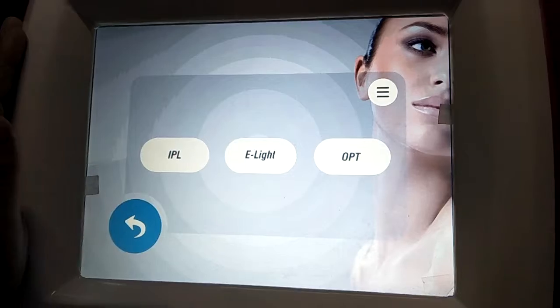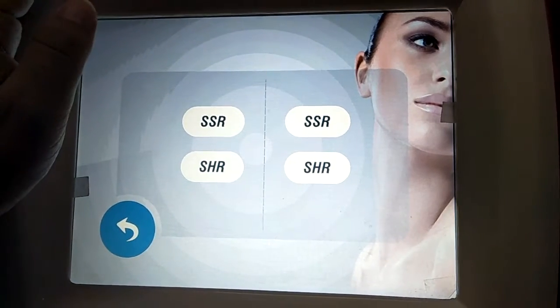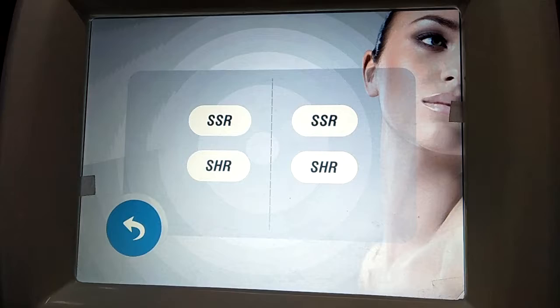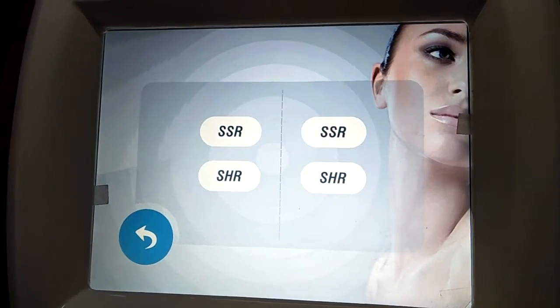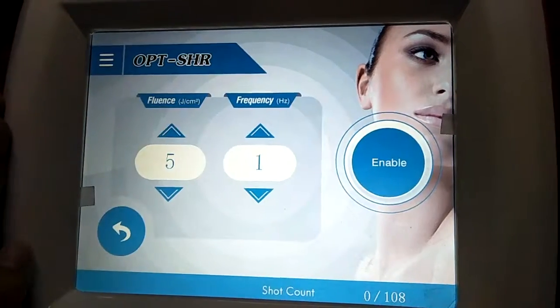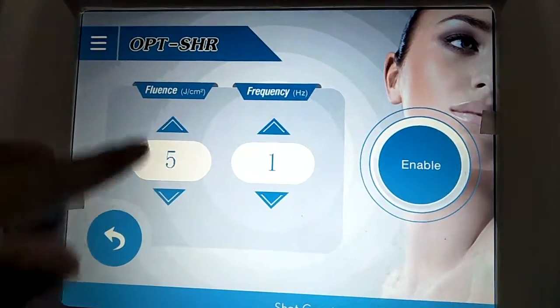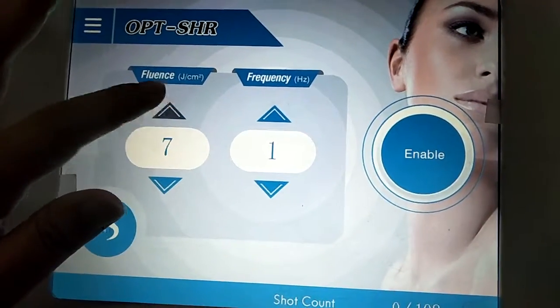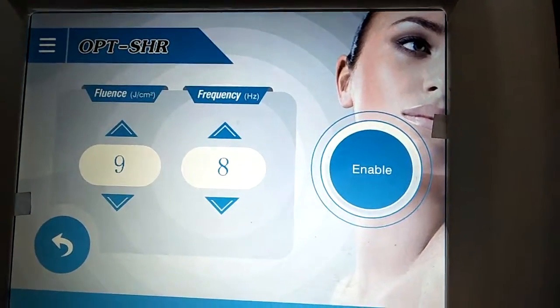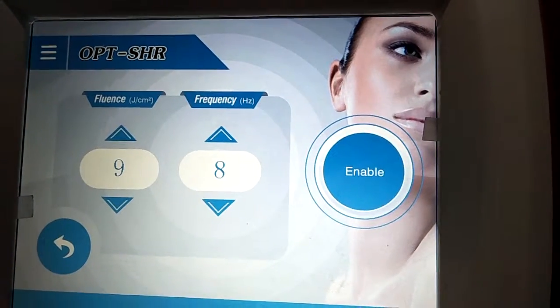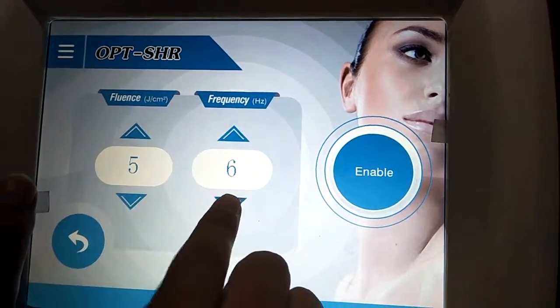Now we want to introduce the OPT function. The OPT function comprises two modes: SSR and SHR. They are both for motion treatment because their frequency is very high — from 1 to 8. For example, we choose SHR. The Fluence for OPT is from a minimum to 30. The frequency is from 1 to 8.